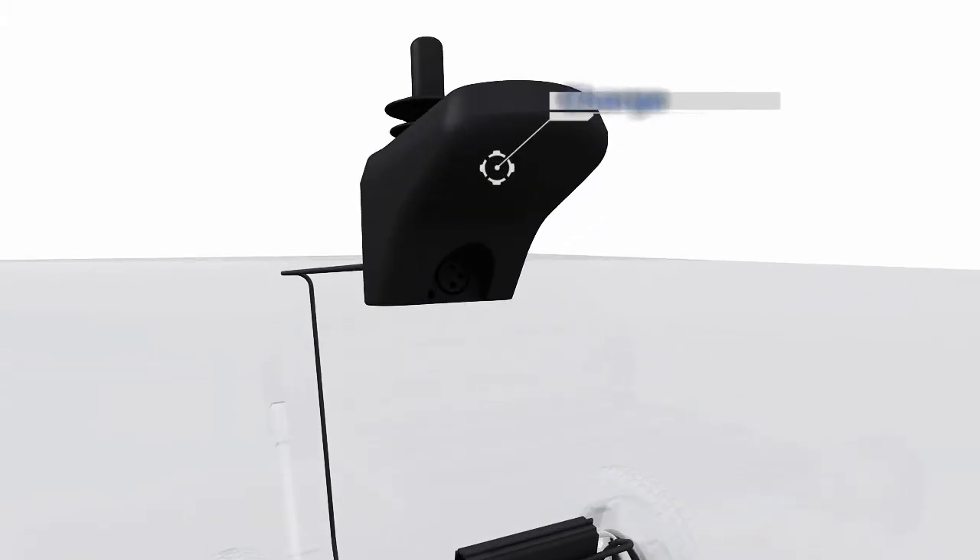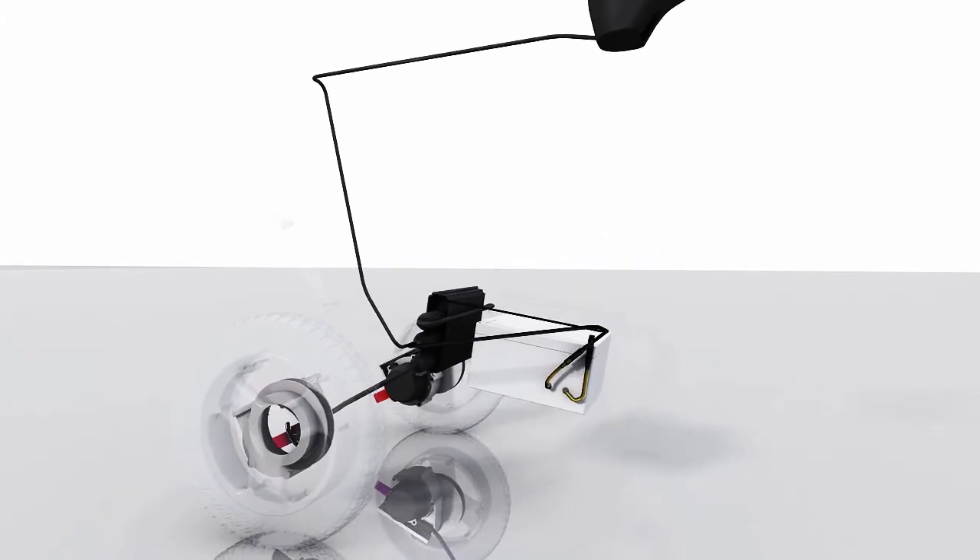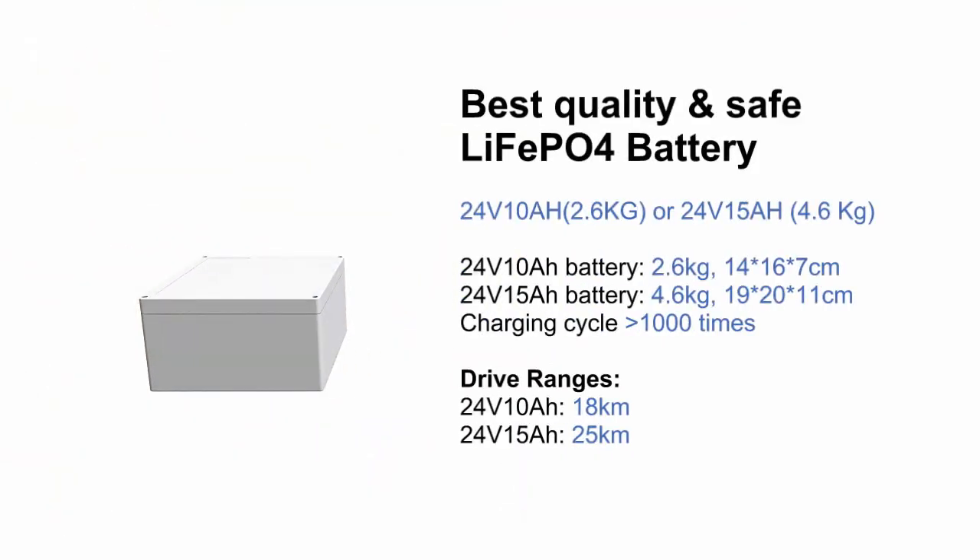Charger port 1 and charger port 2. Best quality LiFePO4 battery.